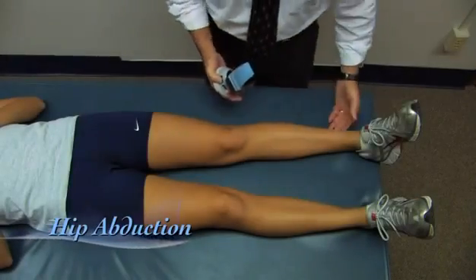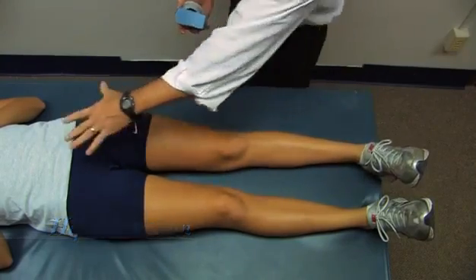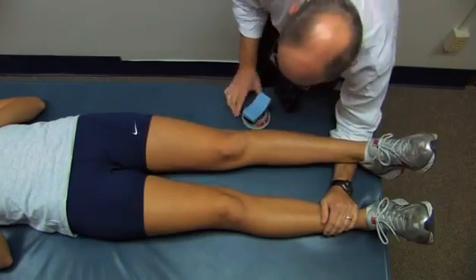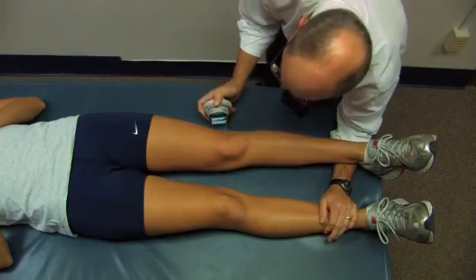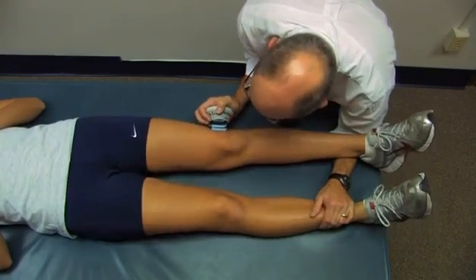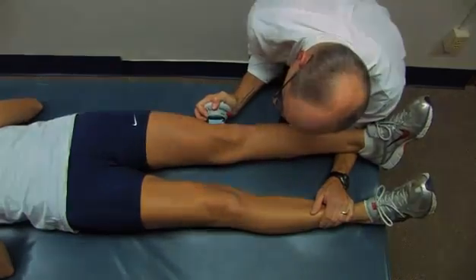Now we're going to measure hip abduction — how forcefully she can pull her leg out to the side. She's in basically anatomical position at the hips. I'm going to support her leg just off the table and apply the dynamometer just proximal to her lateral joint line. It's going to be a second or two to your max, then as hard as you can. Go ahead — out to the side, harder, harder. And relax.